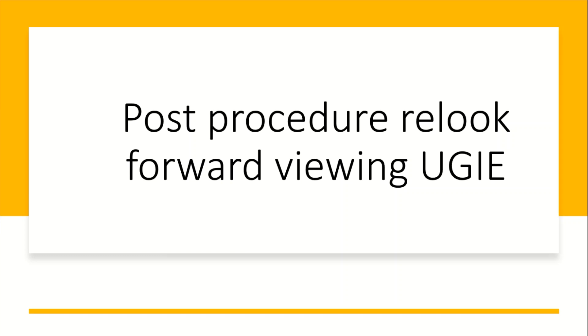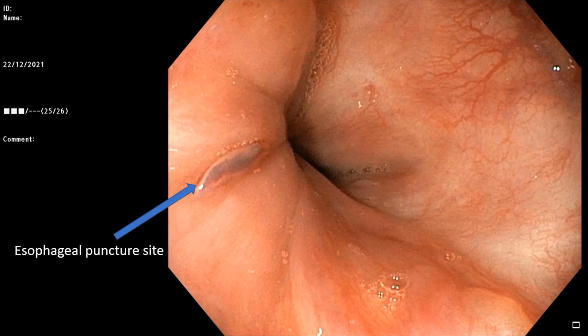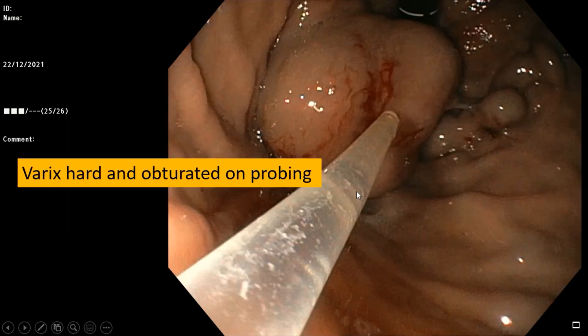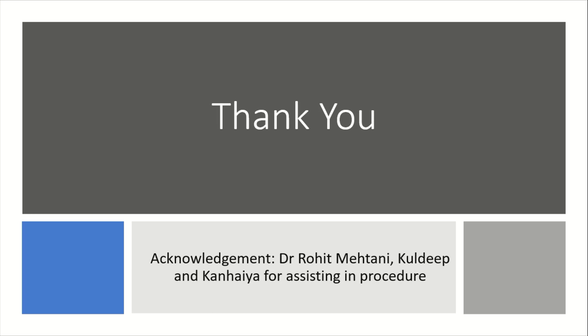Around 10 to 15 minutes after the EUS procedure was completed, we did a forward-viewing upper GI endoscopy. We had injected the coil and glue from the transesophageal route, and here is the esophageal puncture site on forward-viewing endoscopy — a neat and clean puncture site with no bleed. Looking at the fundus, there is again no blood — a clean procedure with no complication. When we probe it with the camera, we find it is completely hard, confirming obturation of the gastric varices. Thank you, and I must acknowledge the help of Dr. Rohit, Guldeep, and Kanhaya for assisting in the procedure.